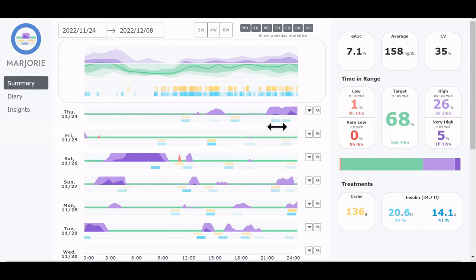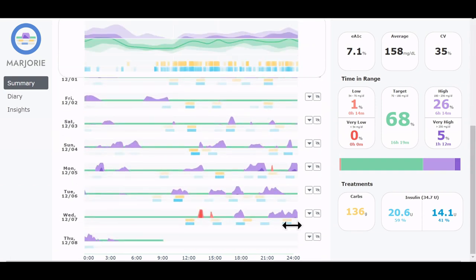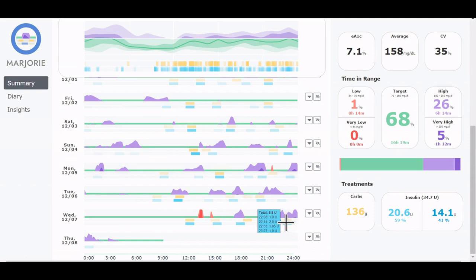We observe that during the night, there are long periods of high glucose. And when we look at the evenings, for example here, we see that the patient often eats despite already having high levels of blood sugar, resulting in problematic nights afterwards.